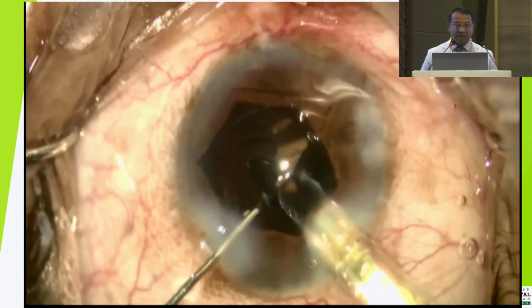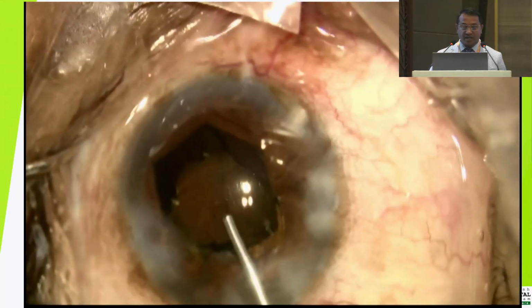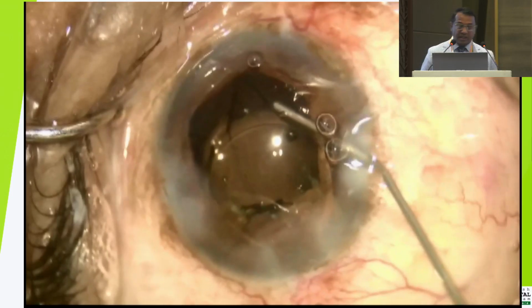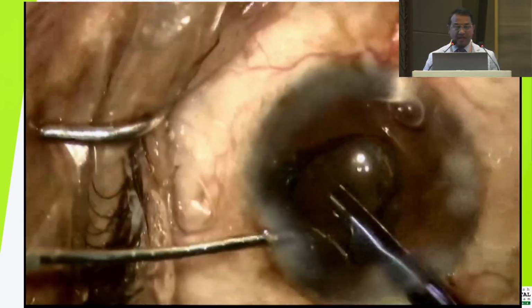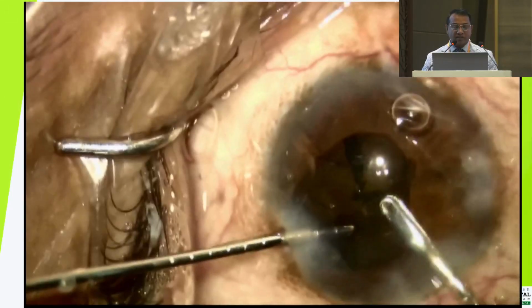During implantation of the IOL, during forward movement, you can see there is a fracture of the optic because of mechanical obstruction. To exchange this, I first inject the dispersive OVD above and below the IOL to protect the endothelium, capsules and posterior capsule. I cut the lens into 3 pieces, holding the lens firmly with the left hand, and cut it through and through.